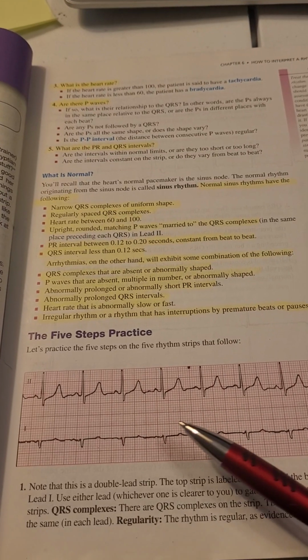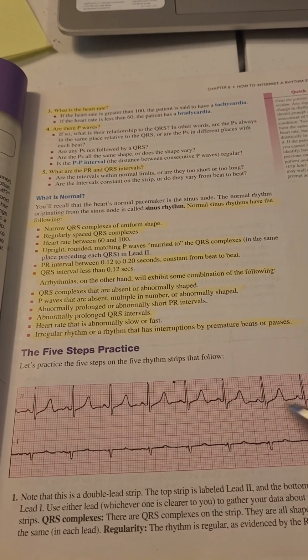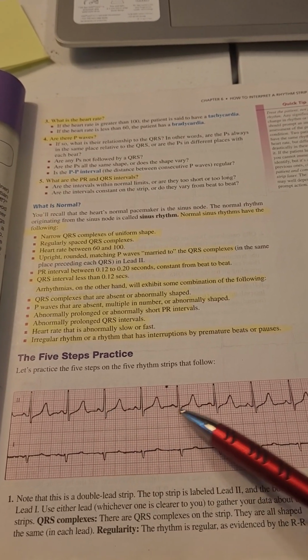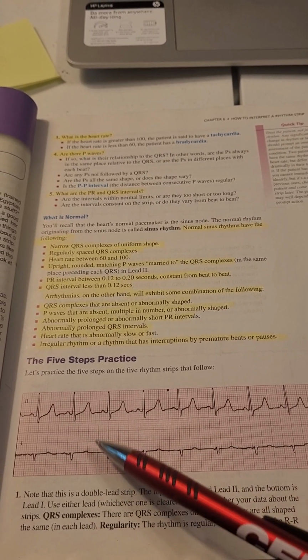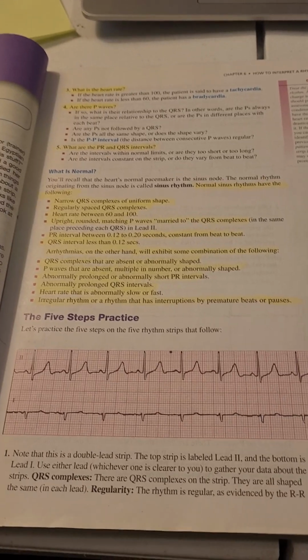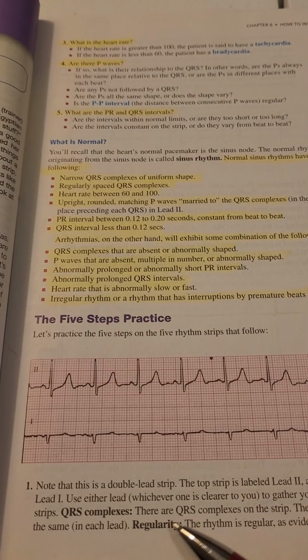Not good, because sometimes there can be artifact and you don't know if it's true or not. If you have one lead, you don't know 100% if it's real. If you have two or three leads, you can look at the other leads and see if it's false or not. So two leads is beautiful.